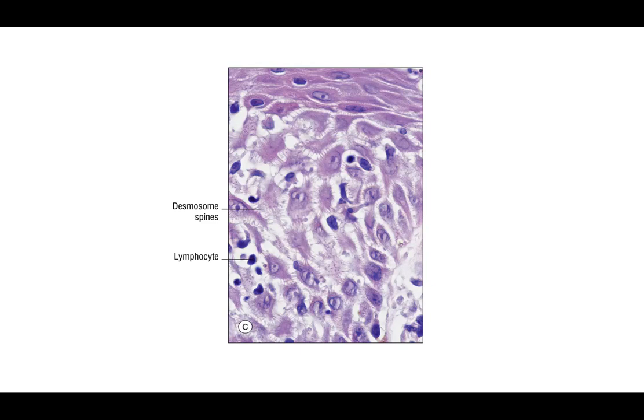Now, if there's strong clinical concern for a cutaneous lymphoma, you should still do some stains just to make sure that these are not heavily CD4 positive and they lack CD7 and CD5 and that there's no clonal proliferation, because you can have spongiotic variants of CTCL. But that being said, most of the time, and especially for exam purposes, if you see this much spongiosis, it's not going to be classic for mycosis fungoides.